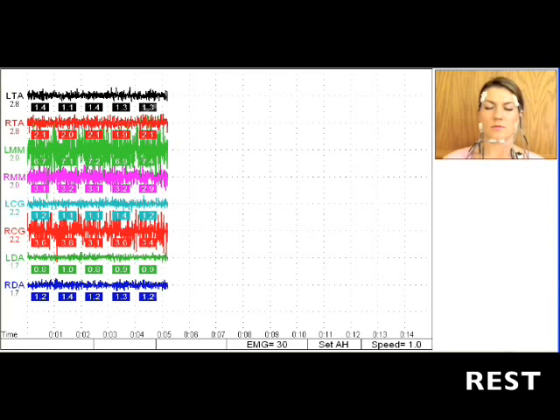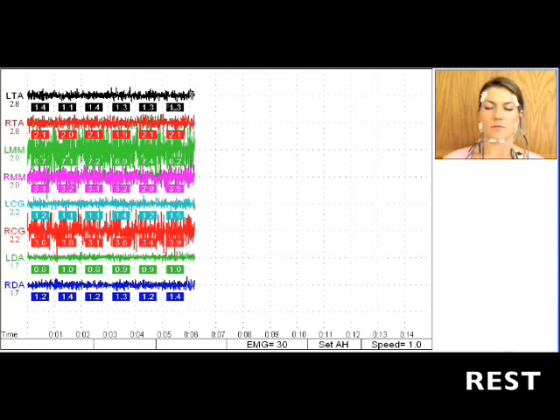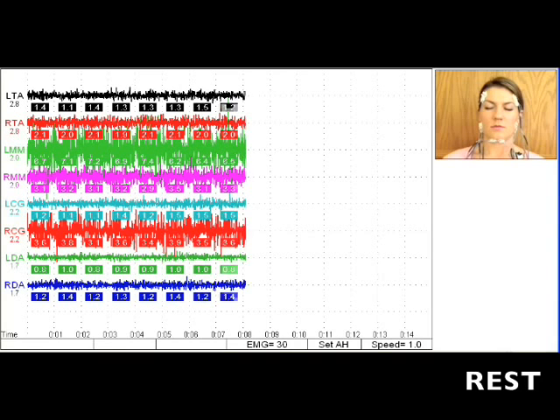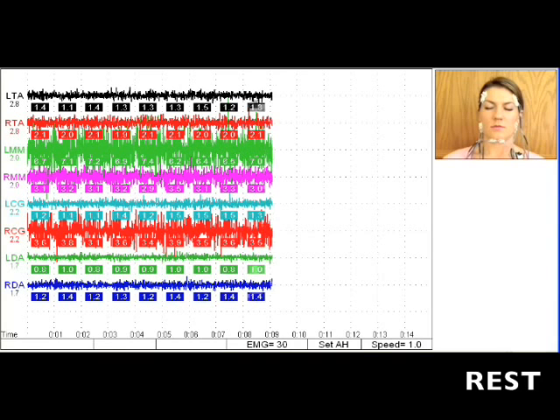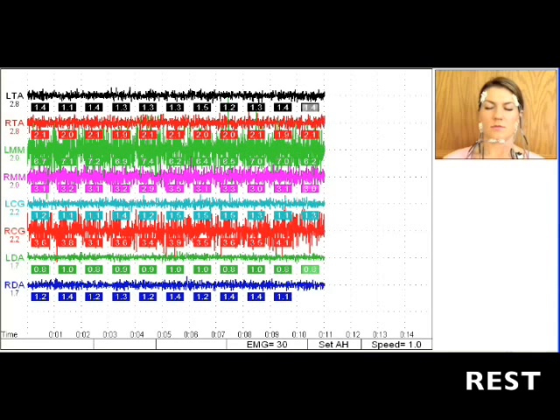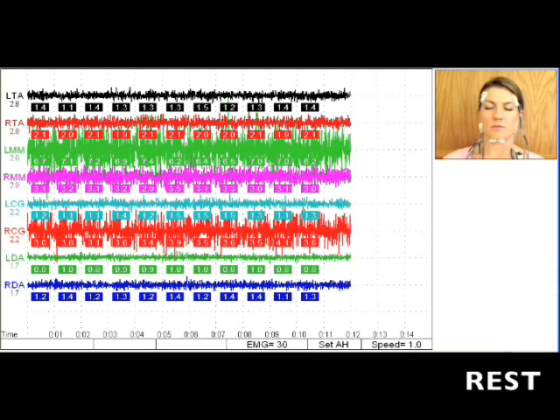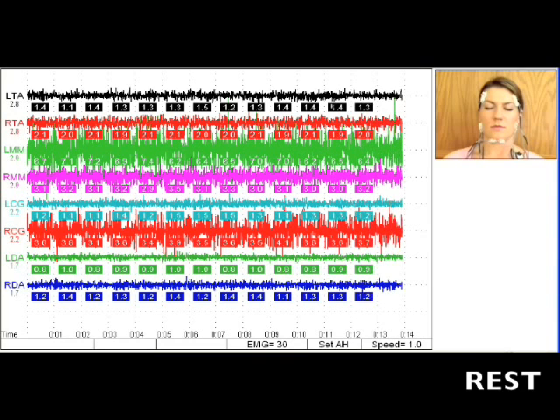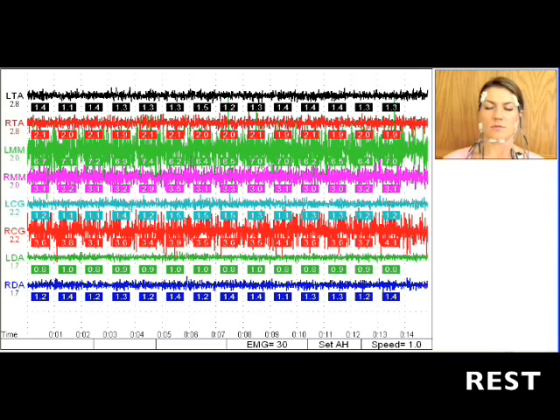If the patient swallows or clenches, you will see muscle activity. If this happens, press the C key to clear the screen. Continue pressing the C key until all eight channels are steady.